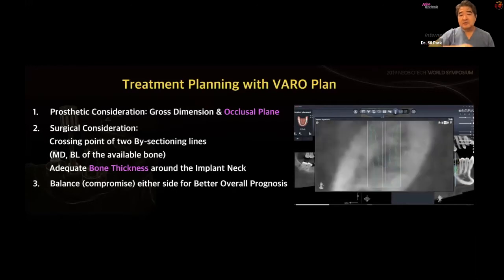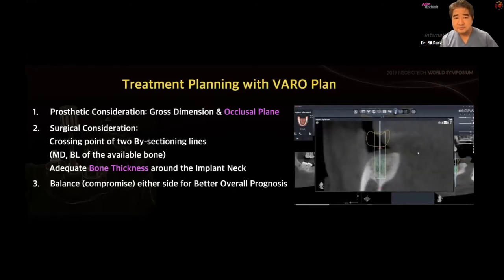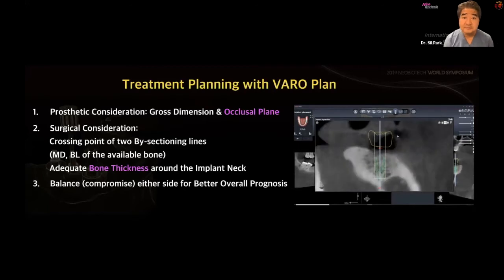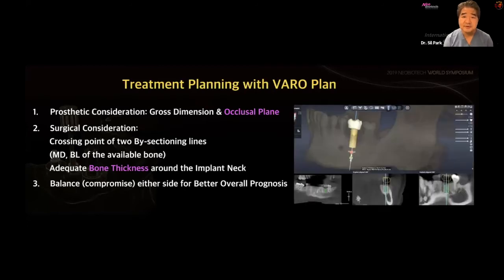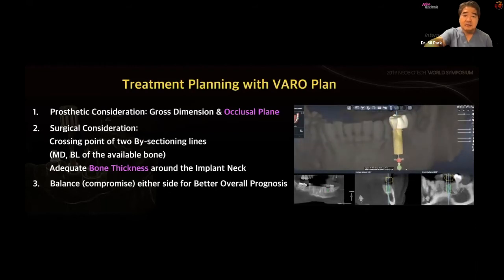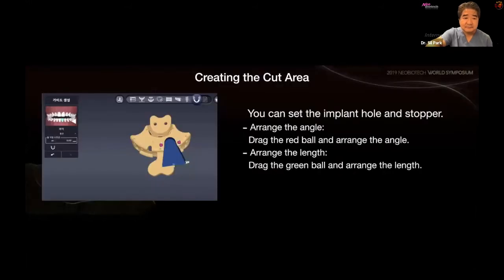So the way we use the software is not really important. So yes, it takes some time. If you try about 3 to 4 cases, then you're going to feel very comfortable using it, right? So in this case, the planning is done from the prosthetic aspect, and the surgical aspect is done. And based on that, we're going to fabricate the guide itself.